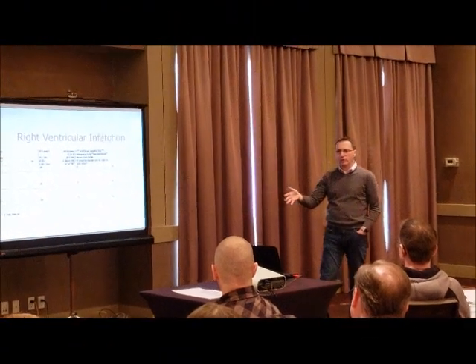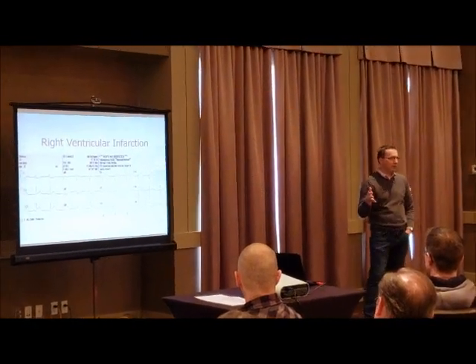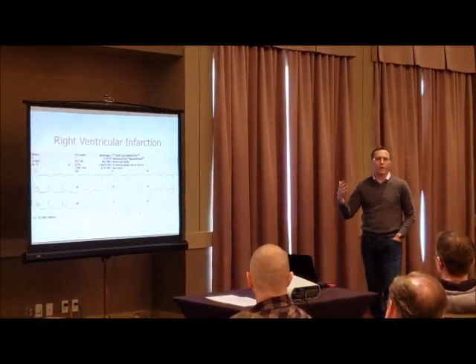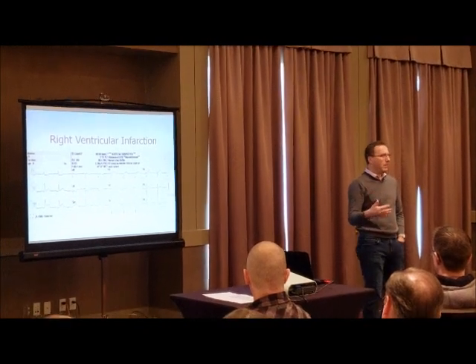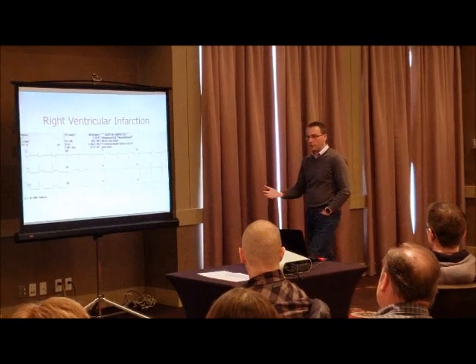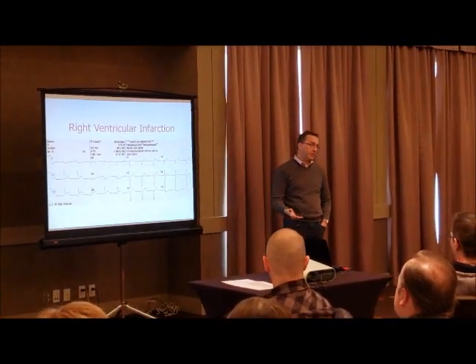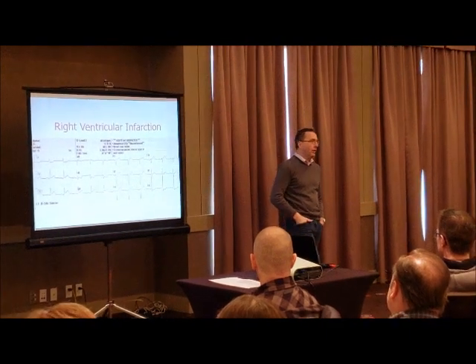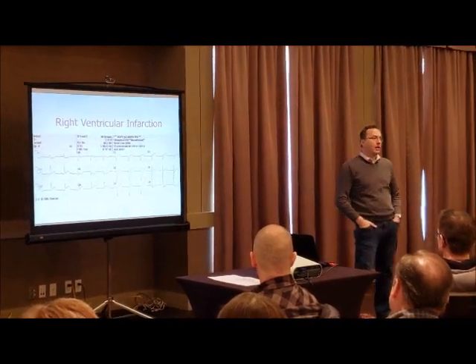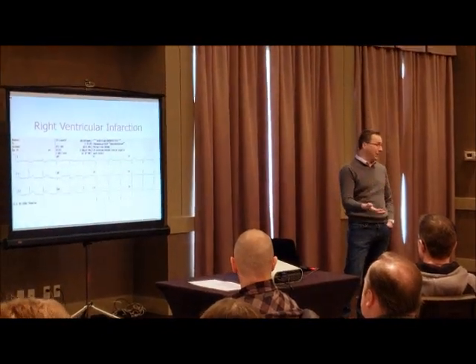Okay, the issue of right ventricular infarction. You can't always predict who will suffer the hypotensive syndrome, but there are some educated guesses that you can make. But step one is to determine whether or not it is actually right ventricular infarction. So I'm going to share this case with you. It's an old case. This goes all the way back to 2001. It's when I first learned about modified right-sided chest leads, and this was one of my early experimentations with it.